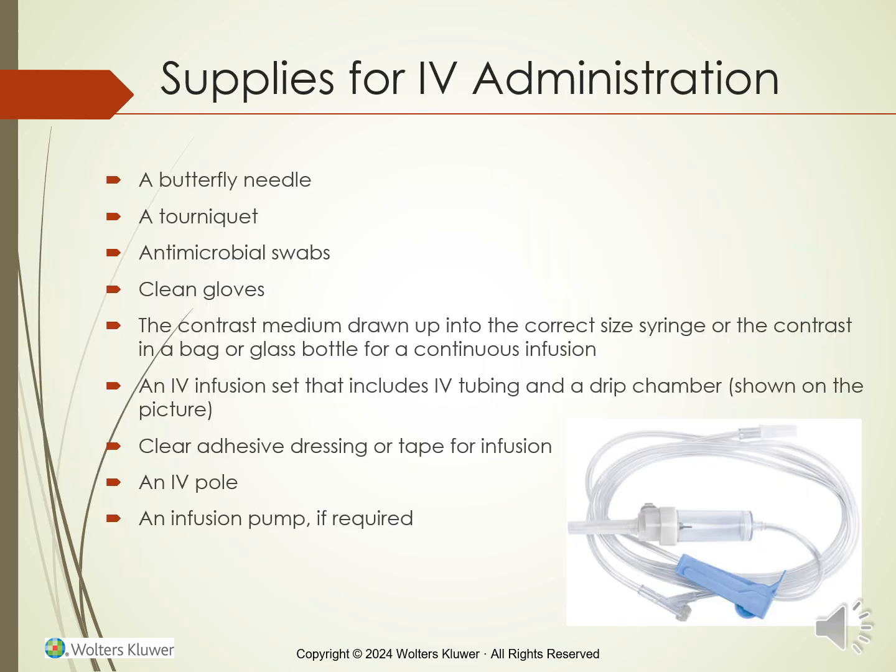When prepping for an IV injection, it is important to gather your supplies beforehand so you are prepared.